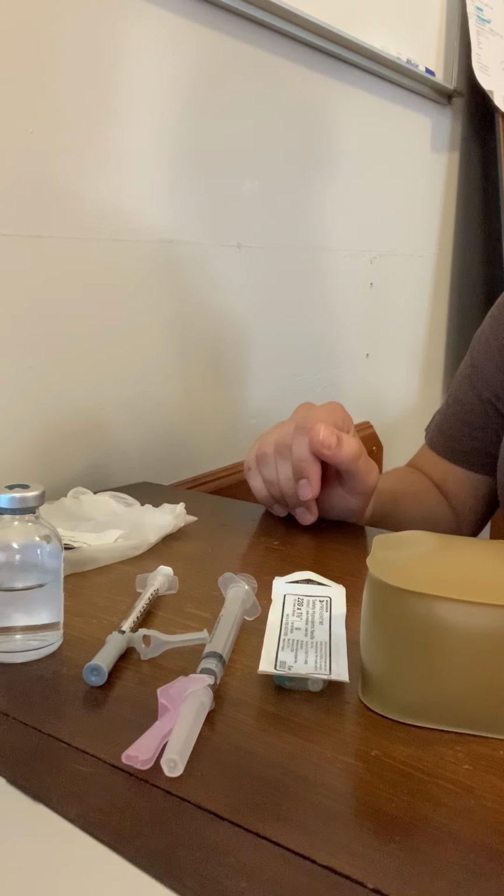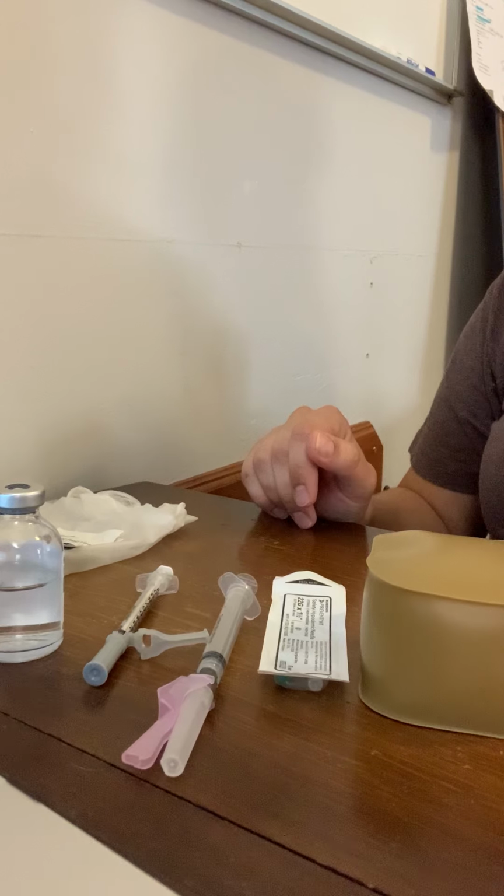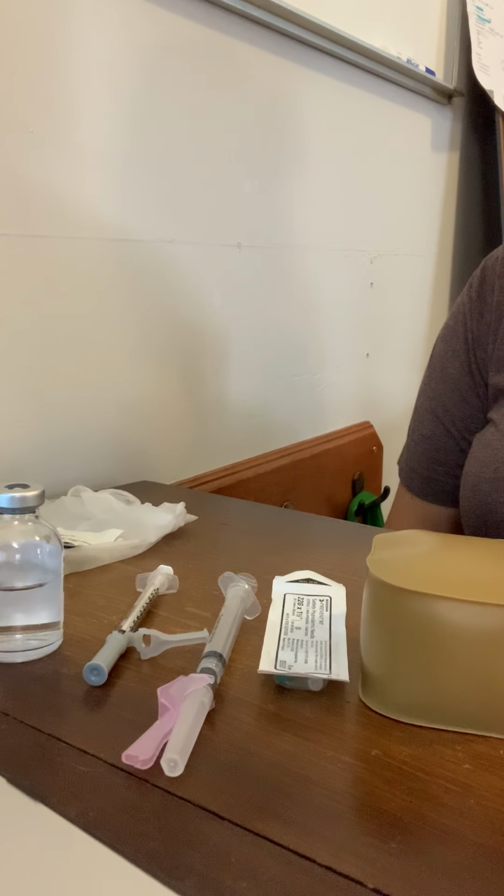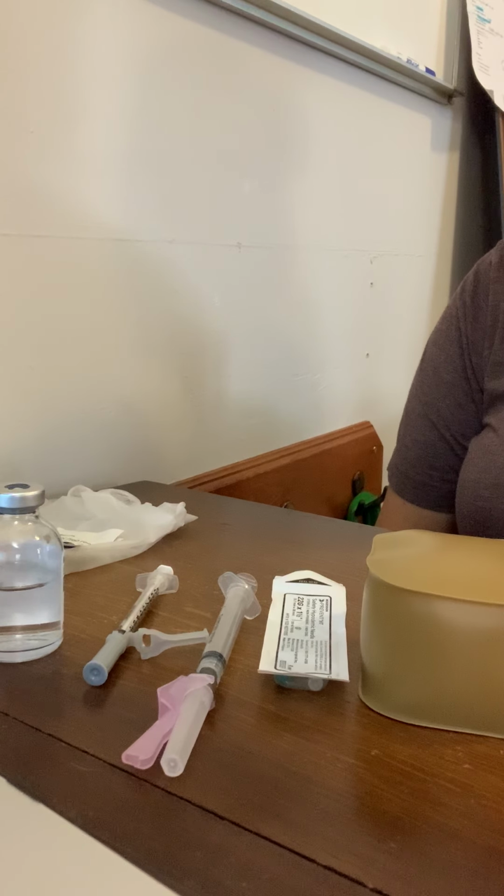This is Lindsey Thomas, and I am doing my IM and sub-Q injection simulation. The first thing I'm going to do in the medication room is verify the physician's orders.